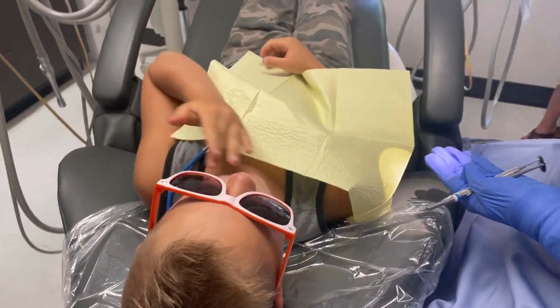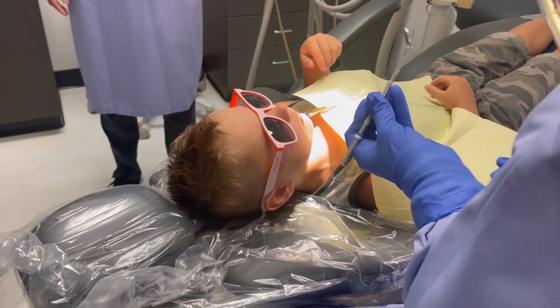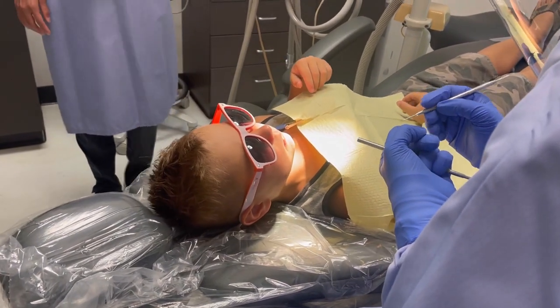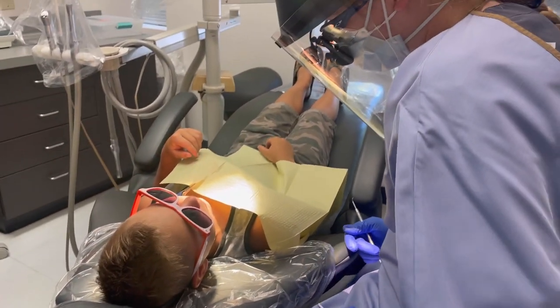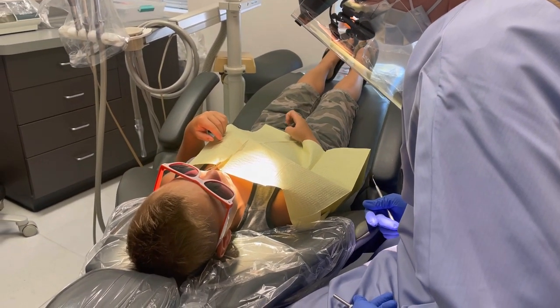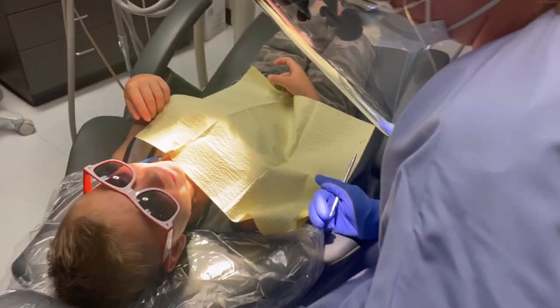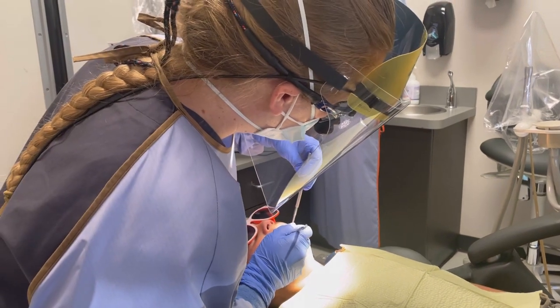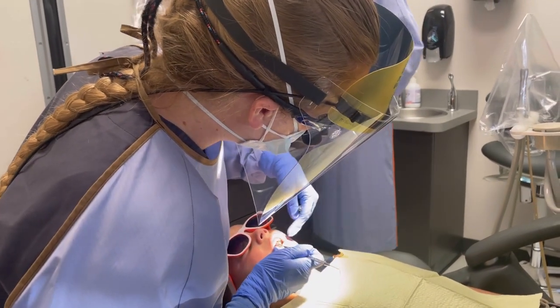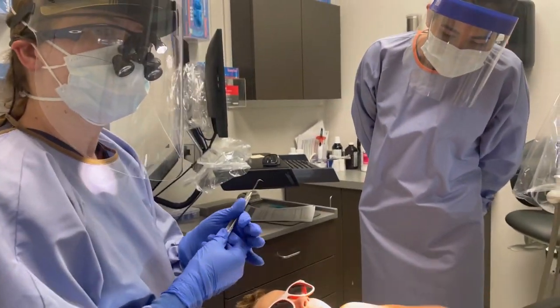And then I've got my little glasses on. I have a couple tools here — this is just my little tooth checker, okay? I just want to check and see what's going on. If at any point you need me to stop or take a break, all you've got to do is just raise your hand for me, okay? I'm just going to take a look in there. It's back between two of the baby teeth, but it's on this tooth right here.